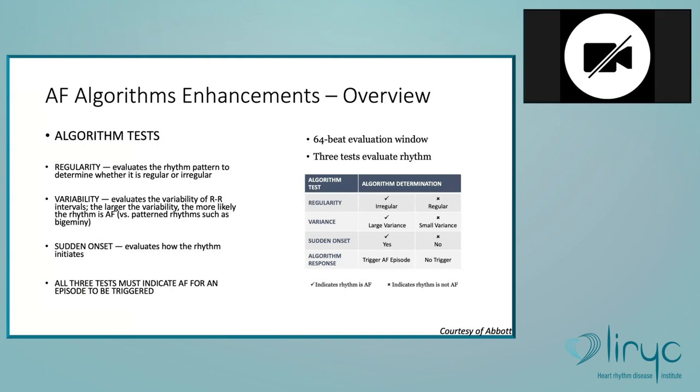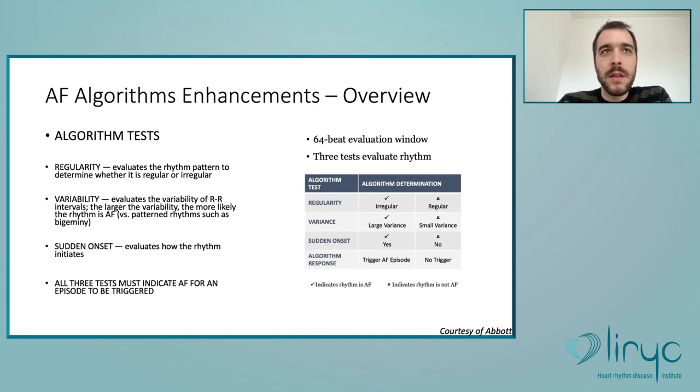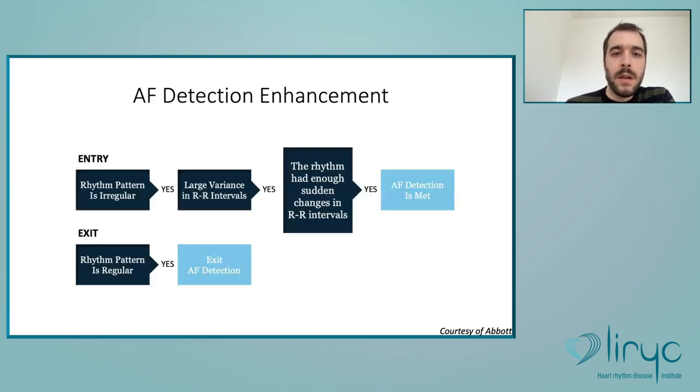So now we'll discuss a bit about the atrial fibrillation algorithms. Just a quick word on that. So the device will do an evaluation on a window of 64 beats, and it will look for the RR regularity, the variability, and it will look also for the sudden onset. So all three must indicate AF in order for an episode to be triggered. So it works as explained in this figure. So if the rhythm pattern is irregular, it will look for RR variability. So if the rhythm had enough sudden changes in RR intervals, then AF detection is met. And then when the rhythm pattern is regular, then it will exit the AF detection.